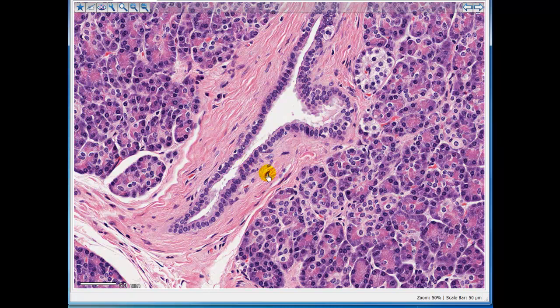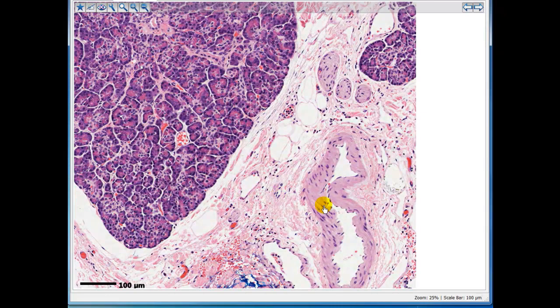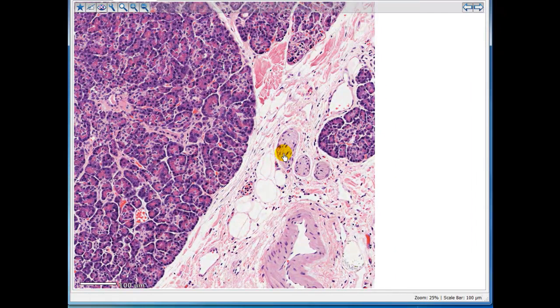And in there you have nuclei that are not circular or ovoid, but they're rather attenuated. These are fibroblasts. They actually produce the collagen fibers. If we zoom out and go to a margin here, we'll see some nerve tissue.